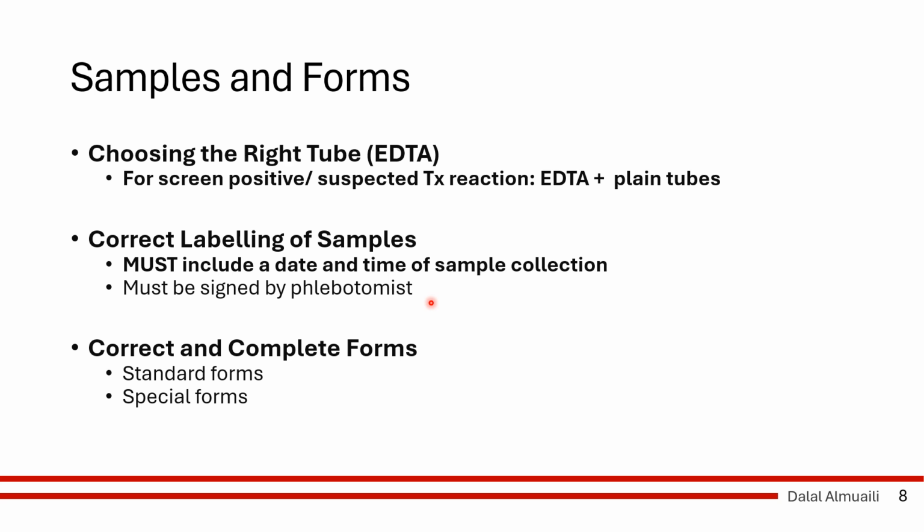It is also very important that the tube is labeled by hand, and has a date and a time of the sample collection. Remember those antibodies that we talked about? All of those 300 antigens and the corresponding antibodies, the ones that make the life of a blood banker very complicated. Those antibodies tend to disappear after 72 hours because they are proteins and they can denature.